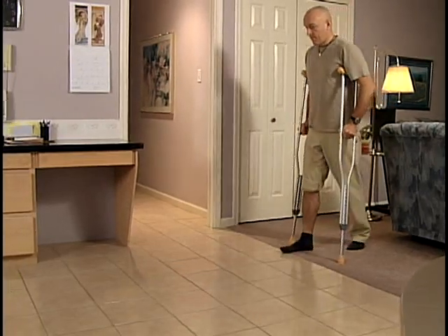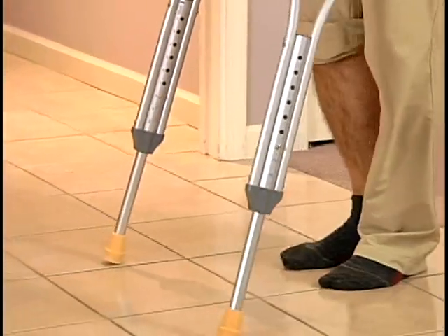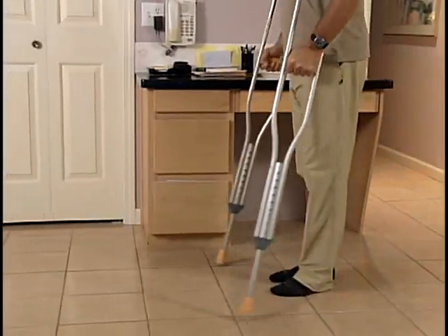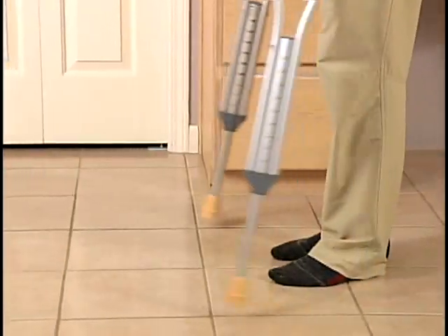Start walking by placing the crutches in front of you. Then, step with your surgical leg. Press down through your arms and follow with your strong or non-surgical leg.